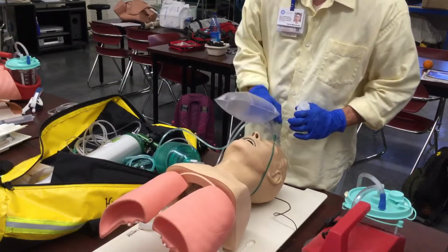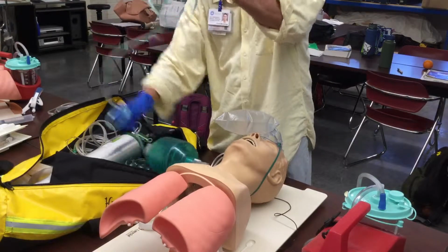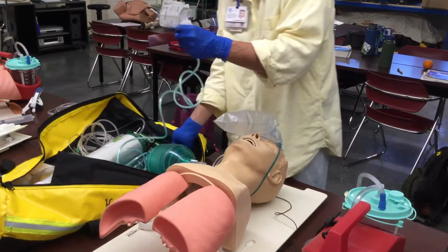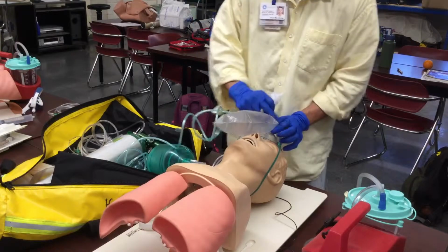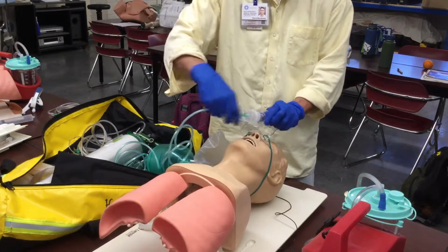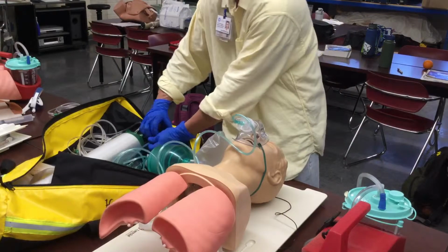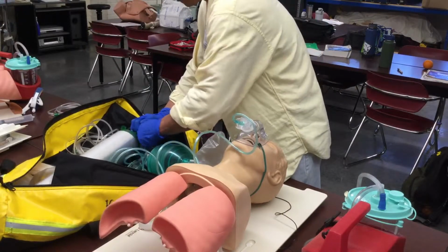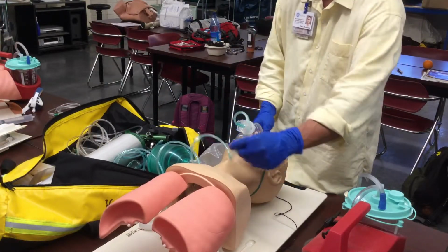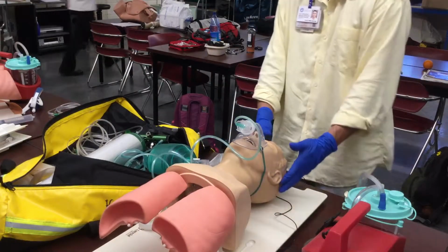I'm going to remove this mask from my patient's face for now. I'm going to connect up the nebulizer with the medication already in there so that it starts misting. Adjust this to 6 to 8 liters. Going to take off the non-rebreather portion and then continue to have my patient breathe normally with the nebulizer treatment. Again, secure the face mask over the patient. Monitor my respirations, lung sounds, and pulse oximetry.